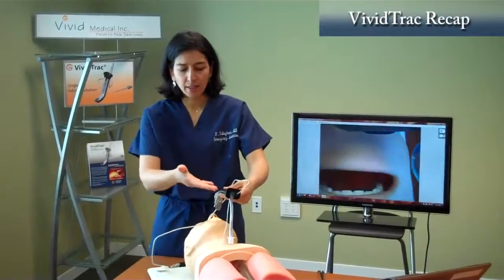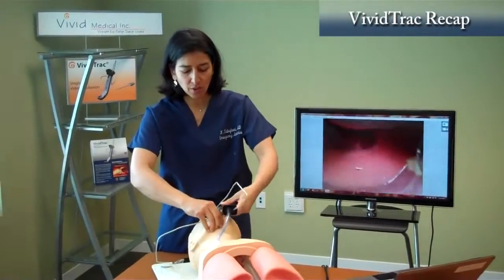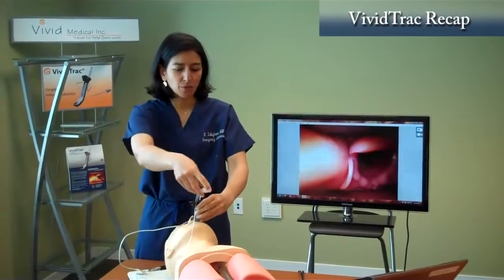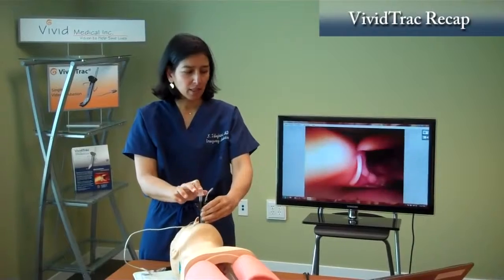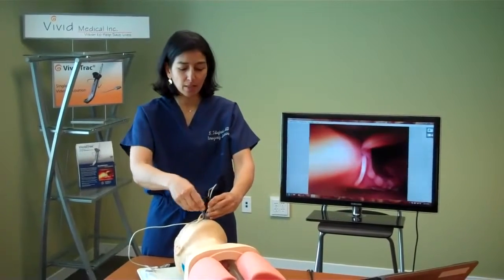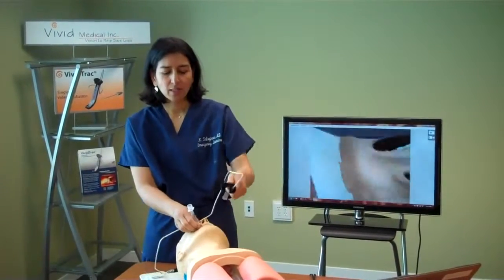You align the Vivid Trac device with the patient's thorax. You insert it into the oropharynx very gently. Your vocal cords will come into your view. You gently press the ET tube directly into the cords, watching the direct visualization as it intubates. You release the ET tube from the device, and you take the device out of the mouth.